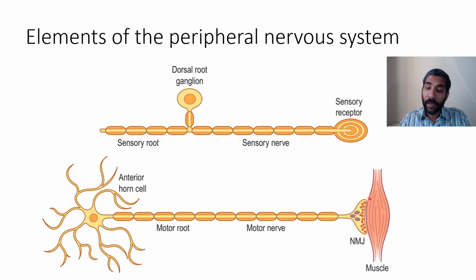Okay, now if we look at the electrical activity that is produced by the muscle, which is the EMG or the electromyogram, we can figure out some of the problems that were happening before in the motor neuron and higher stages, right? Especially if you combine that with nerve conduction studies.